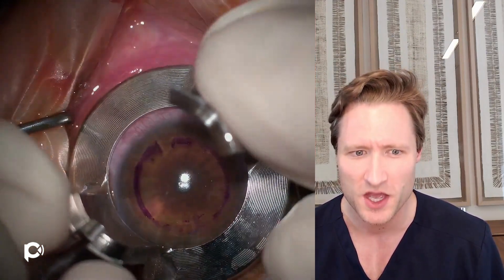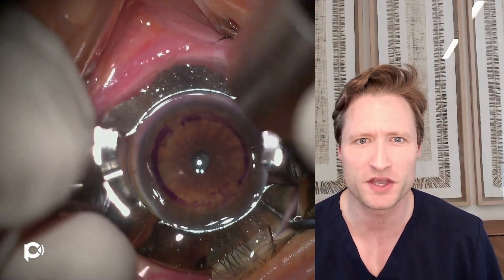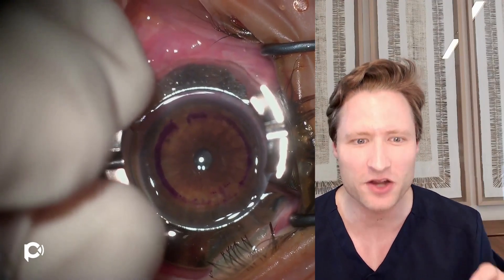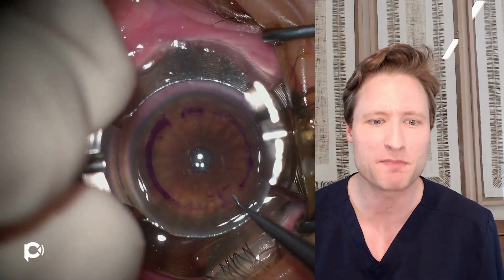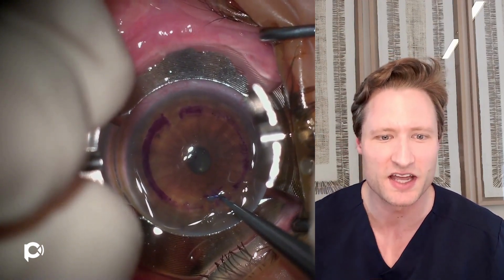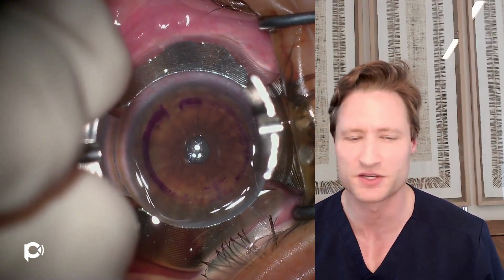Here is a suction ring which we're going to insinuate around the surface of the eye underneath the eyelid speculum. My assistant is squirting the cornea because in order to get good suction you want a water- and airtight seal — so we wet the surface of the cornea to get good suction. Now we have the suction applied and I'm using what's called a pocketing hook. This pocketing hook is being put down into the base of the incision and rotated to dissect laterally a one-millimeter pocket just adjacent to that primary incision.